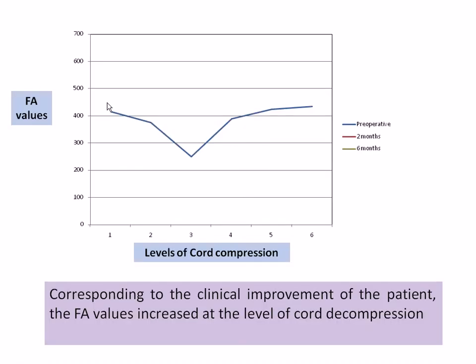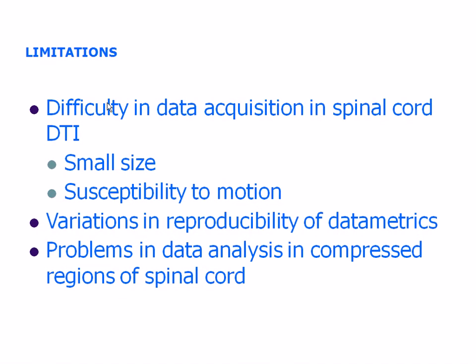So does it reverse with decompression? You can see that this was the preoperative level. As the patient improves, the datametrics also improve, and at 6 months, when the function of the patient was very good, the datametrics had also improved.